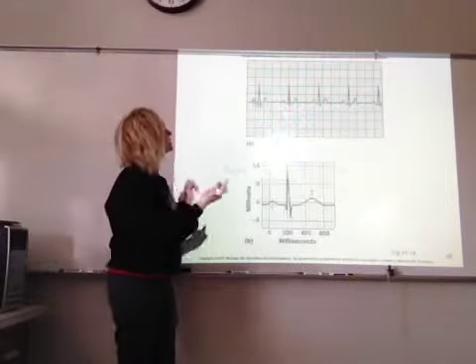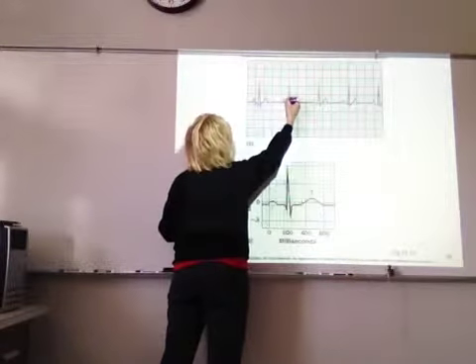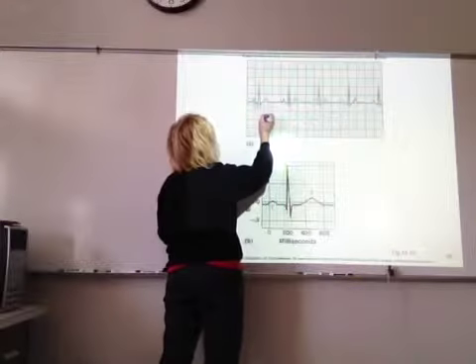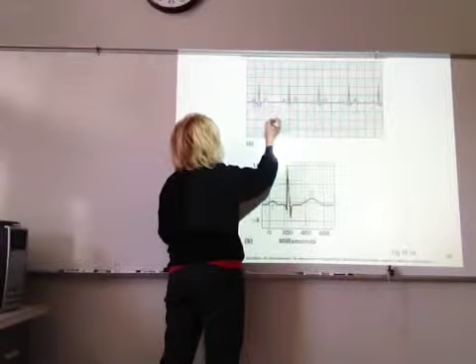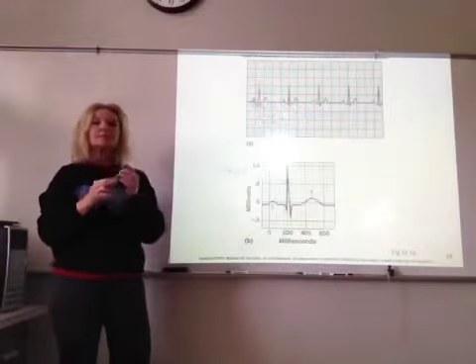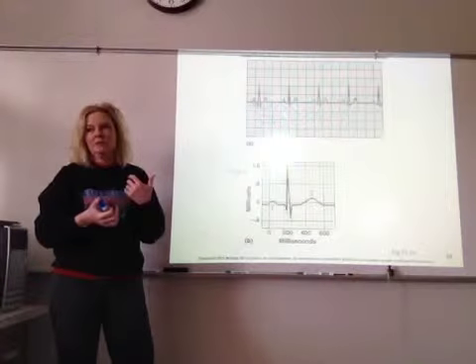The distance between, if I measure from P to P, that is my entire cycle. So the distance between there shows how often your heart beats.